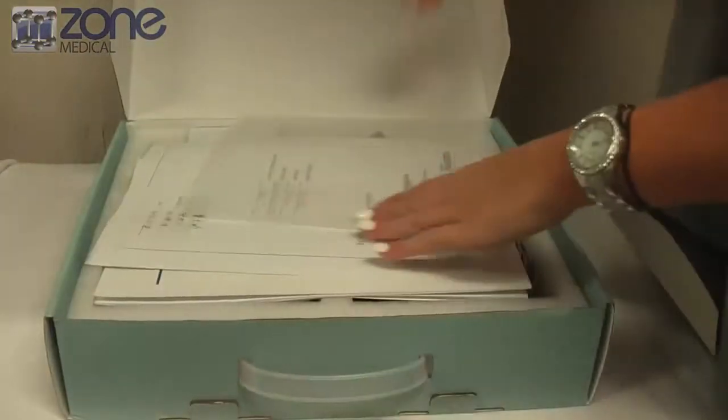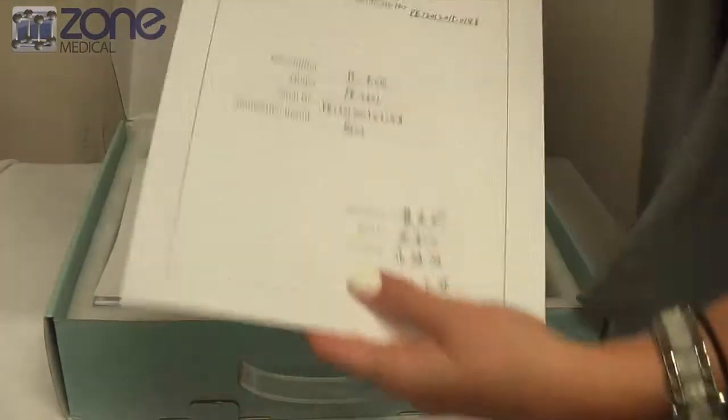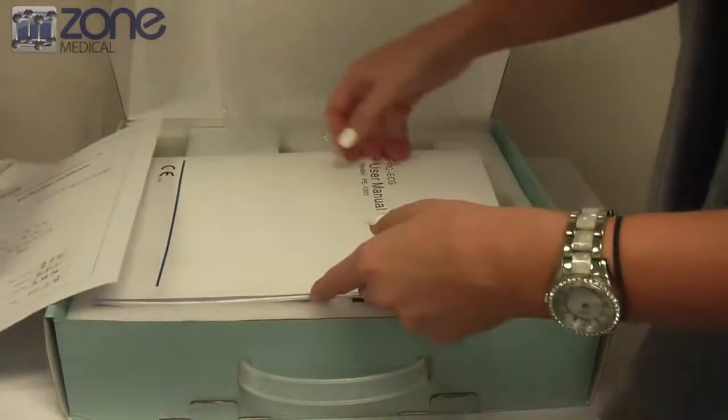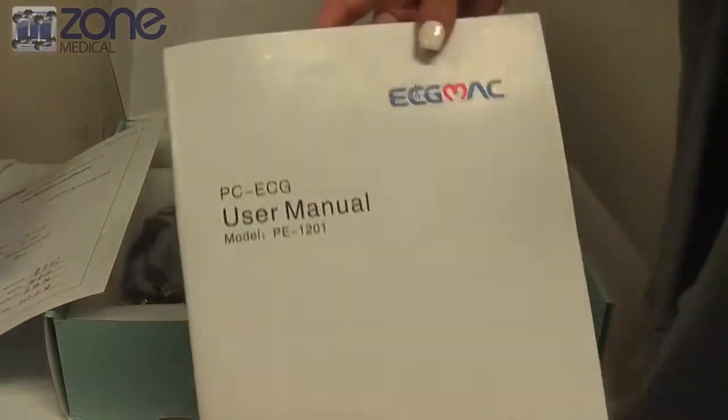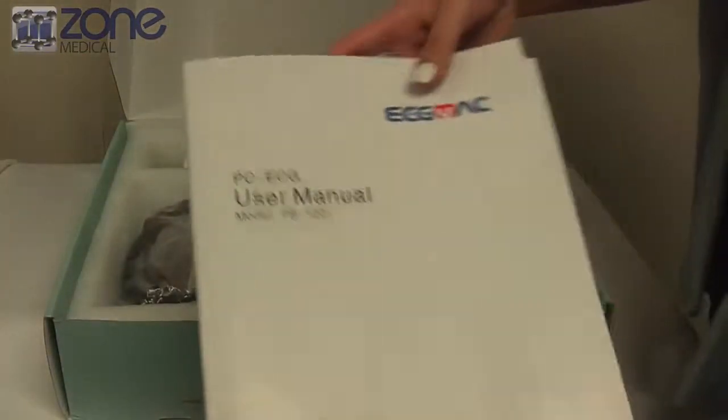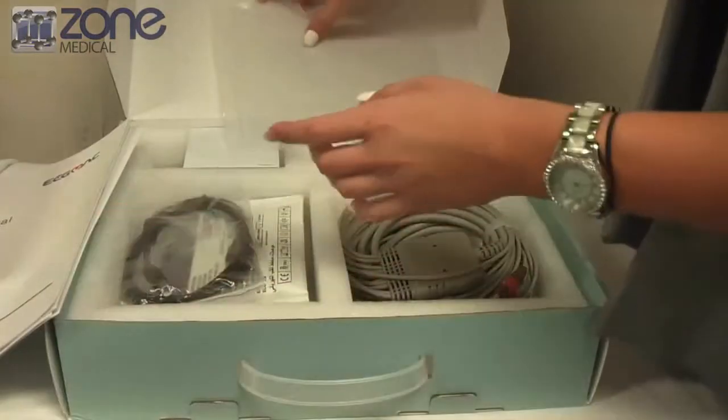Once you open the box, you'll find the verification certificate, which has the serial number on it, and also the user manual. Just make sure that you hold on to both of these, especially the verification certificate, because you'll need it for the registration process.